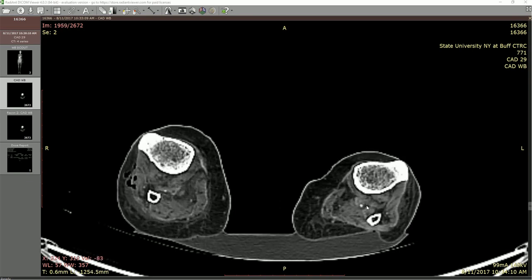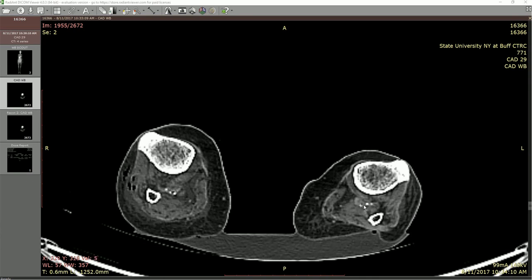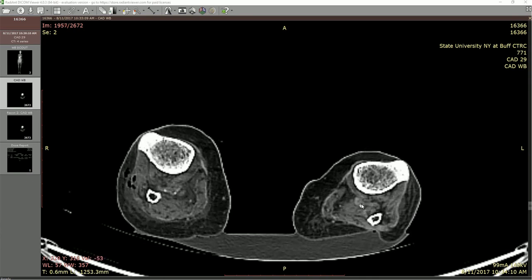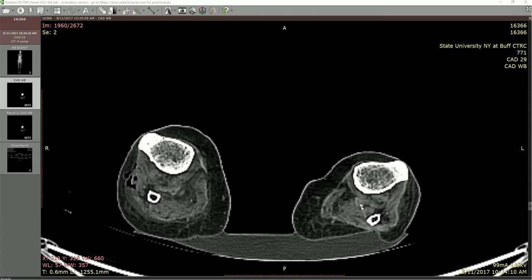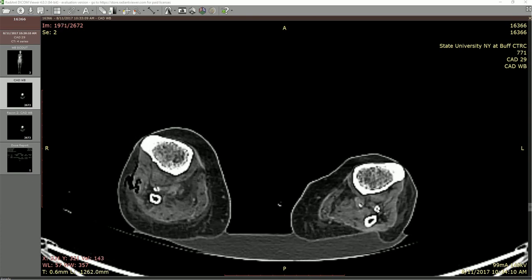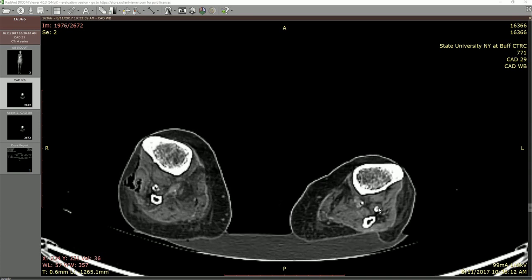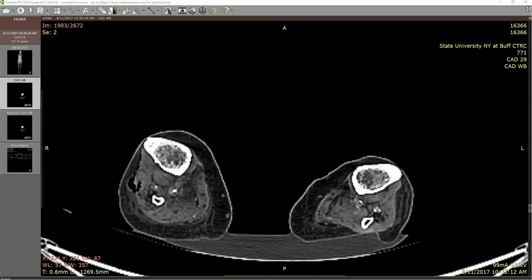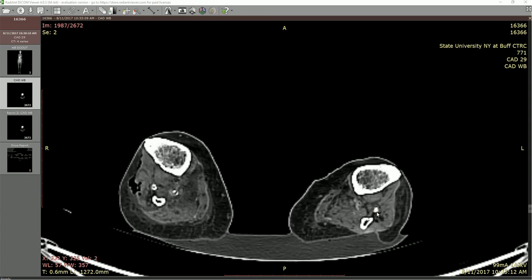A little interesting thing here: this is the continuation of the popliteal artery, and we're actually seeing — remember this is calcified with a lot of calcification in the vasculature — here we can actually see where it's splitting into the posterior tibial and anterior tibial artery. This gives you a perspective of exactly where that happens and the continuation of those. This would be the anterior neurovascular bundle — the anterior tibial artery and deep fibular nerve — and then the posterior tibial artery and tibial nerve in the back.